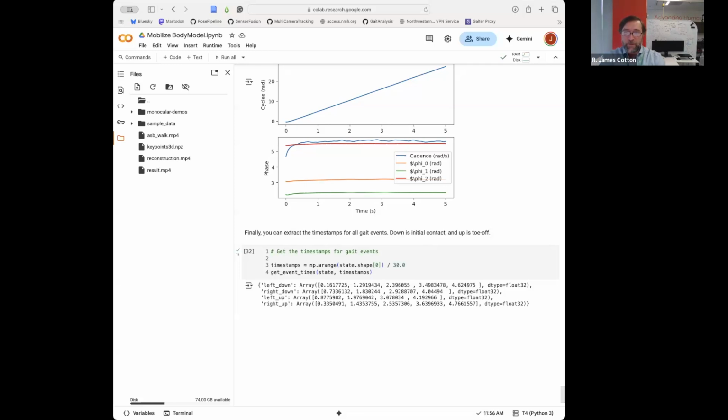What is the process of the calibration of the multi-camera system? Is there a possibility for non-calibration? Right now, we take that big checkerboard there, and we roll it around the room. We are using some code from Anipose lib. We're updating that to use some more recent code from them, but it sometimes is annoying.